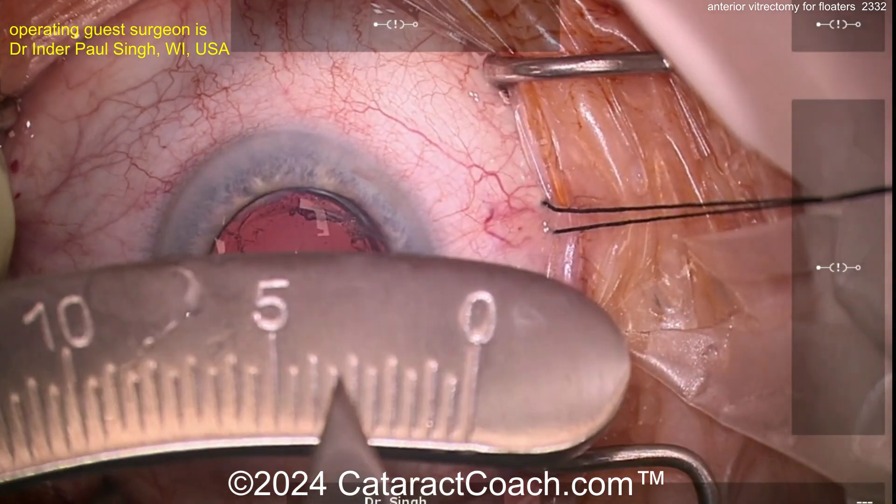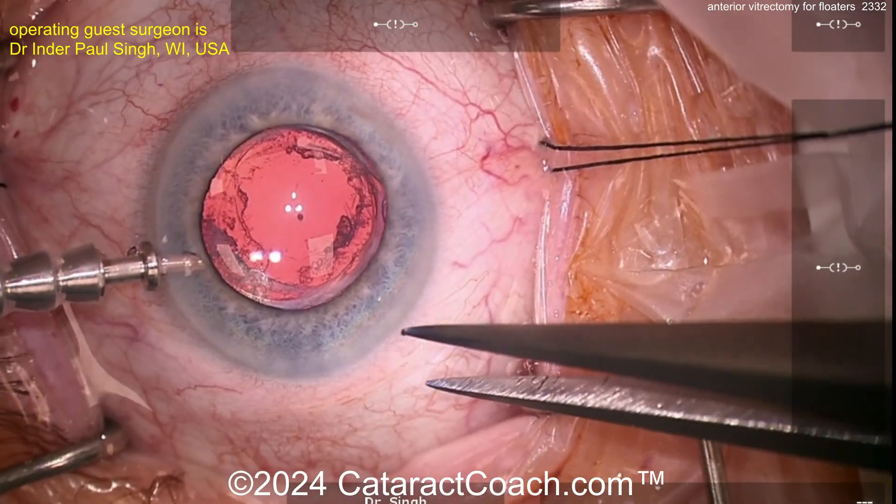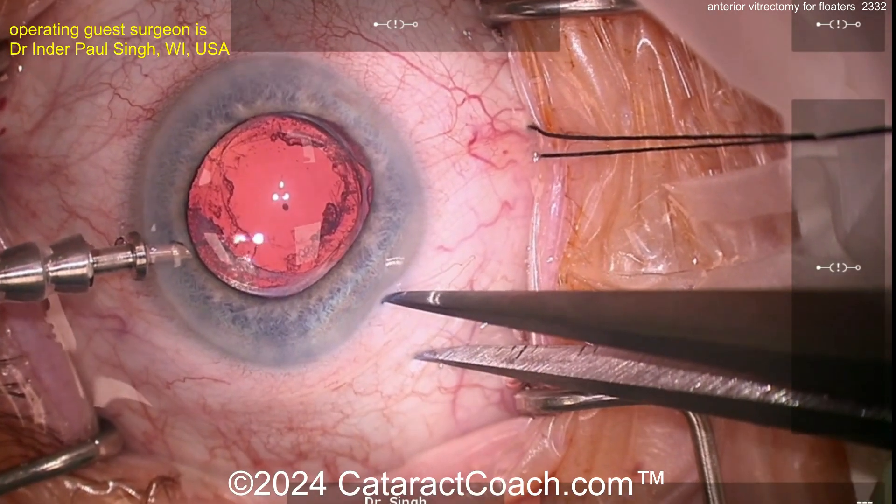I'm going to measure about three and a half millimeters behind the limbus, taking my calipers to make sure it's about three and a half. I'll measure at a position convenient for hand placement — this is the left eye, so I'm going superior temporal here.